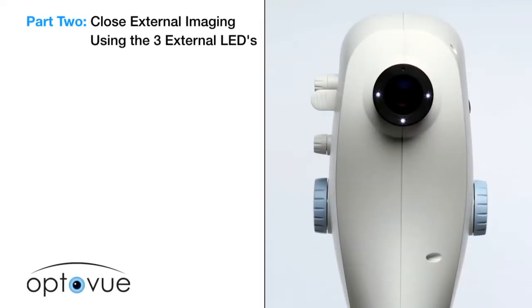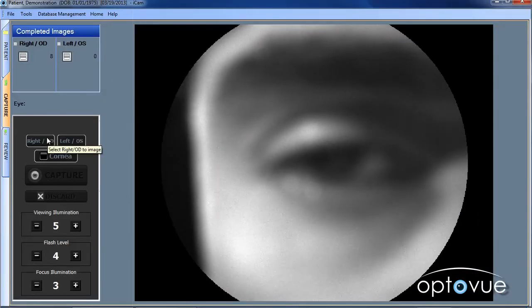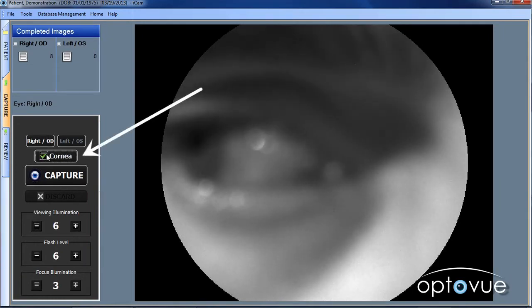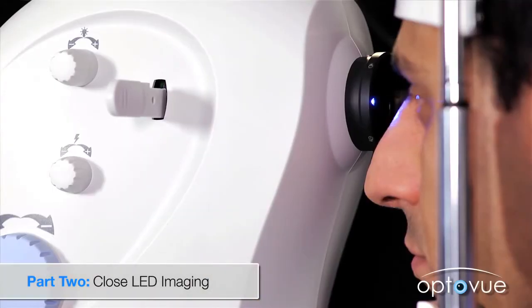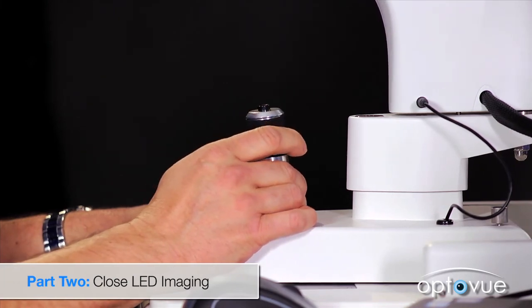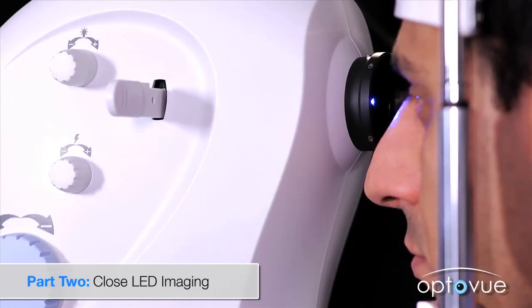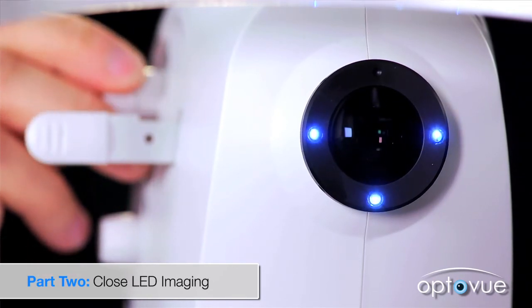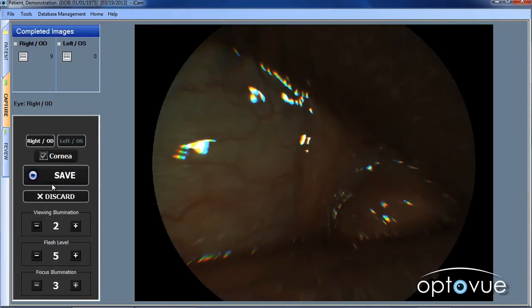Close external imaging using the three external LEDs. For this next type of external image, move the diopter compensation selector to the C marker and select the eye. Ask the patient to look at the external fixation light and select the cornea button. Move the focus knob all the way in the plus direction — this will allow the operator to reach the closest focus position for capturing the external anatomy. To image a larger area, move the focus knob back towards zero while adjusting accordingly with the joystick. Push forward until the exterior of the eye comes into focus. Adjust the external LED using the upper control knob or the software. The LED will flash at capture — the lower the LED setting, the lower the flash intensity. Once satisfied with the focus and illumination, capture the image. Evaluate and save.